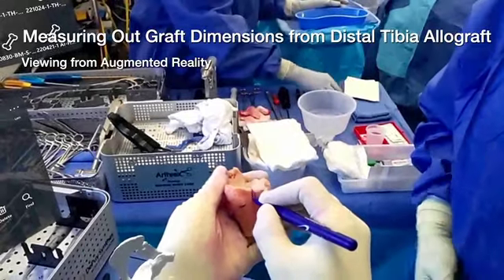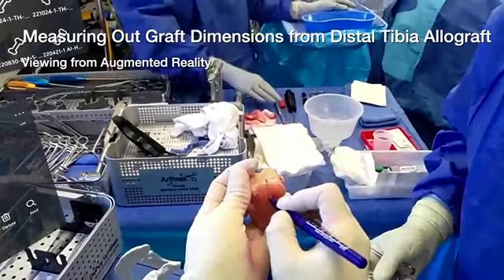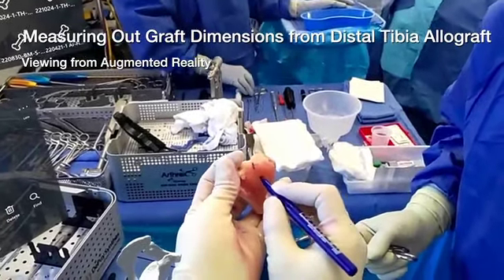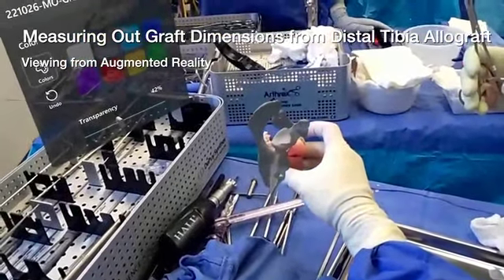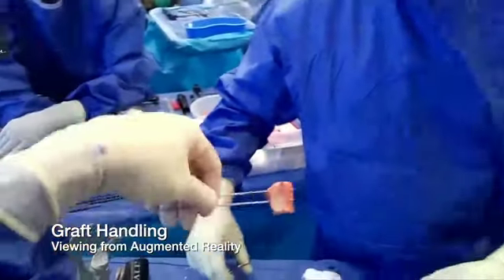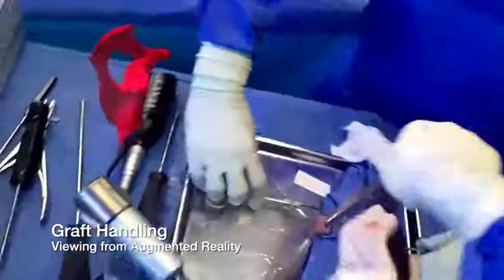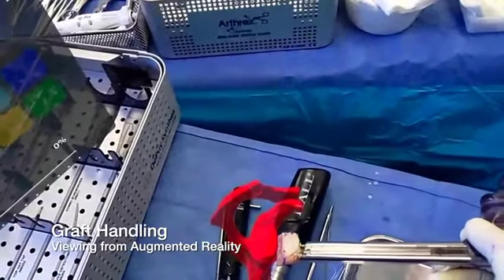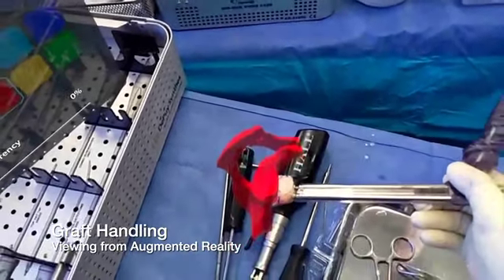A trapezoid-shaped bone block measuring 1 by 2 by 1.5 centimeters is marked from the posterolateral corner of a distal tibia allograft of the contralateral limb. We then insert 2 wires in the center of the graft parallel to the articular surface. We overdrill these wires, tap the holes, and insert screw caps. The construct is then attached to the double barrel cannula, which facilitates graft handling and insertion.